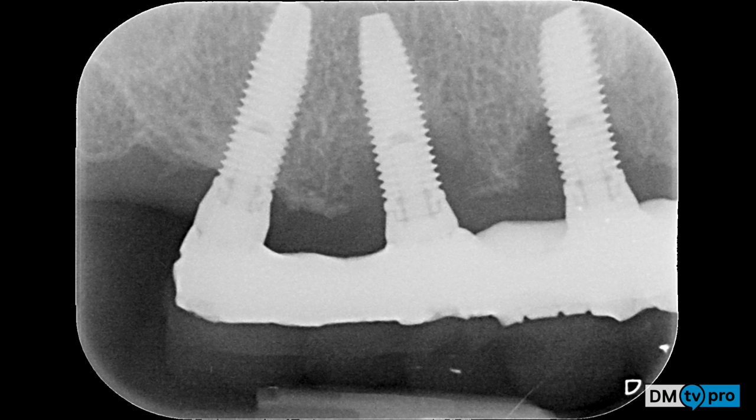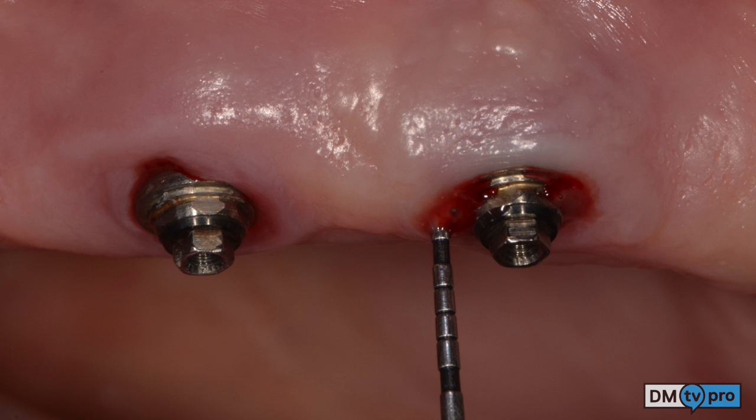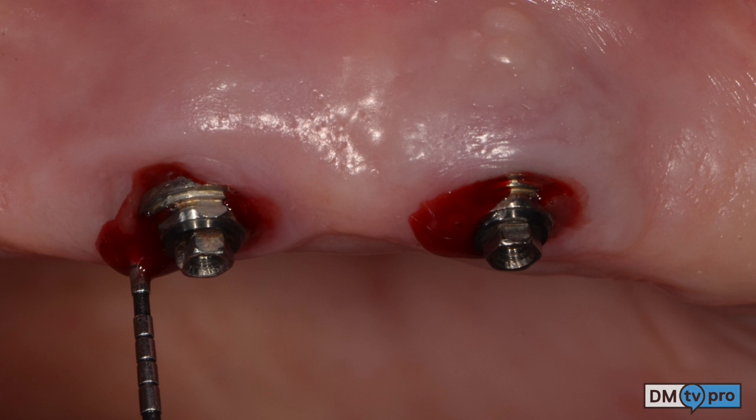In a follow-up recall, two implants under a Toronto bridge show severe intrabony defects. Once the prosthesis is removed, clinical examination reveals probing pocket depths of 8, 8, 6, and 8 mm from mesial to distal. A surgical intervention is planned.